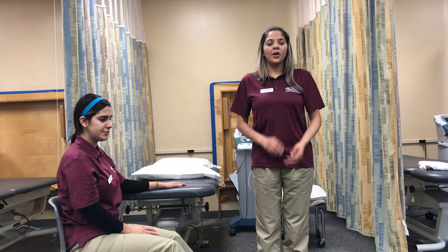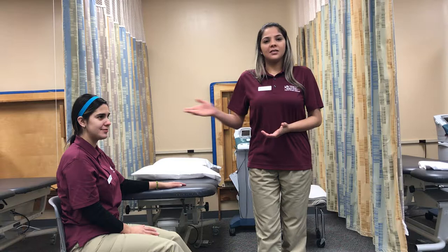Hi, my name is Andresa. I'm a student physical therapist assistant at Miami-Dade College. Today I'm going to be demonstrating how to apply a hot pack to the lumbar area.